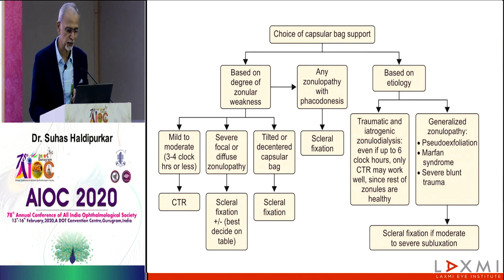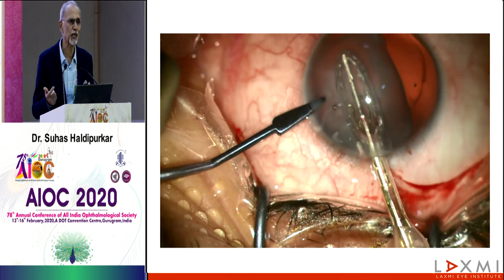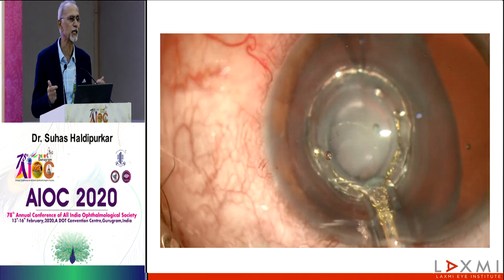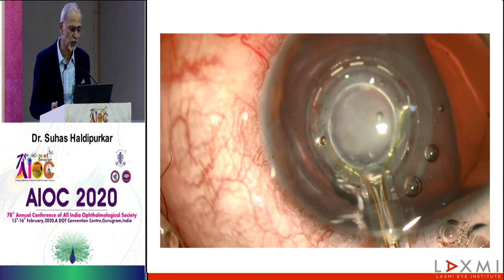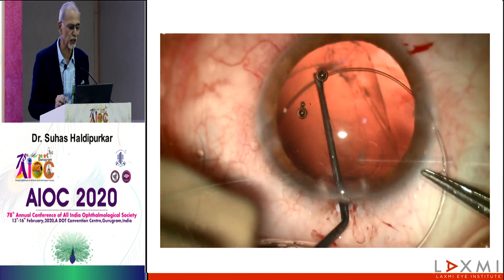Now this is a situation where the defect looks quite huge, but the saving grace for me right from the beginning, even before I started, was there was no phacodonesis. Maybe it was long standing, but there was a lot of anterior capsular fibrosis, so I had to do rexis either with Zepto or with Femto. Zepto suits me, and the reason you do that is with anterior capsular fibrosis, doing rexis even in a normally supported capsular bag is difficult. In such cases, it's more difficult.